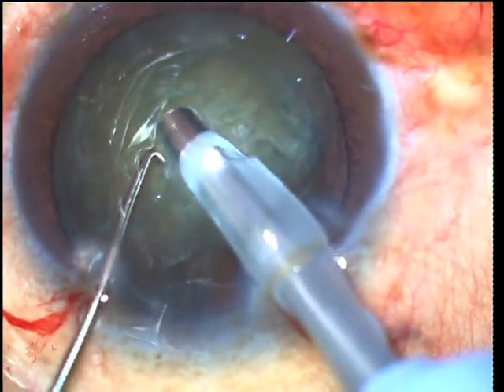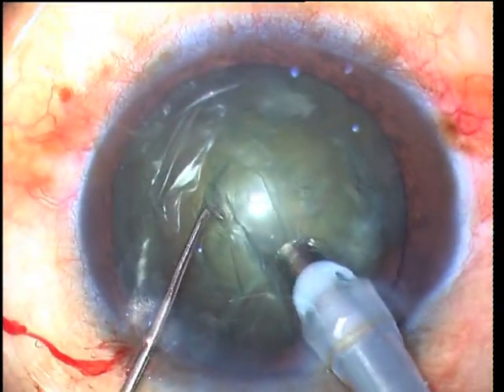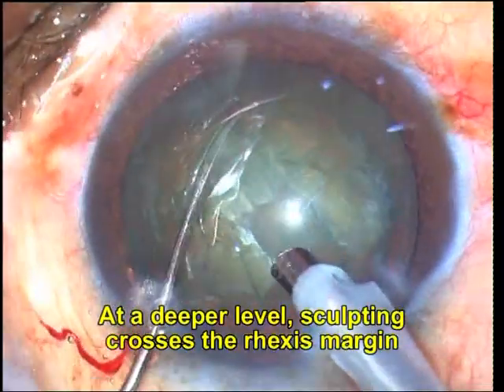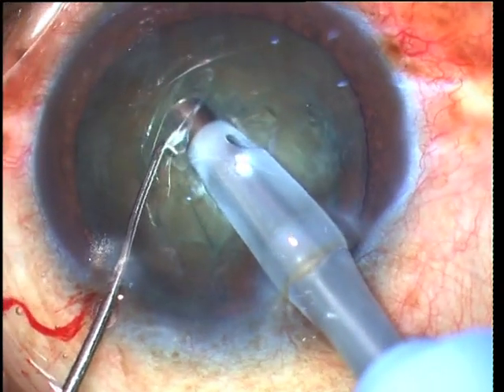However, once the groove is adequately deep, it can be taken beyond the rhexis margin. The groove is also widened to an approximate size of about 1.5 phaco tips, and this allows the phaco tip with sleeve to enter within the groove for deeper sculpting.